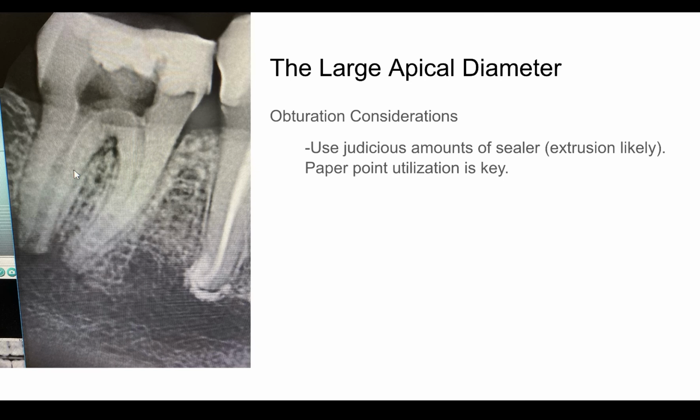Lots of different ways to apply it, but I think using a paper point here would be the right way to go to control the amount of sealer that you have. We're not looking for a puff here. This tooth unfortunately doesn't set up for that kind of situation.